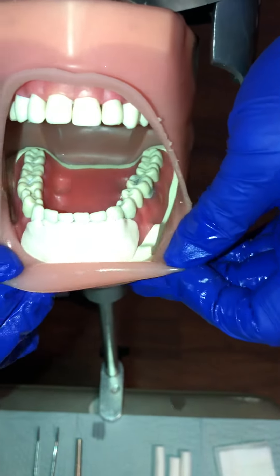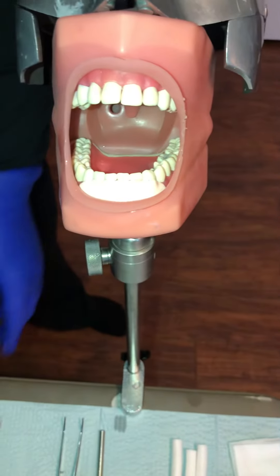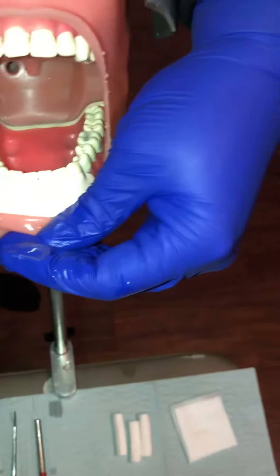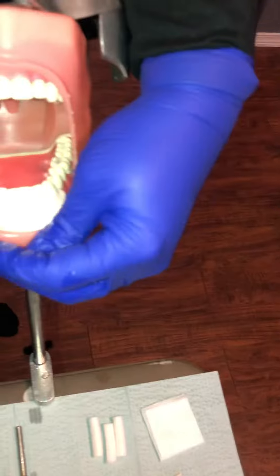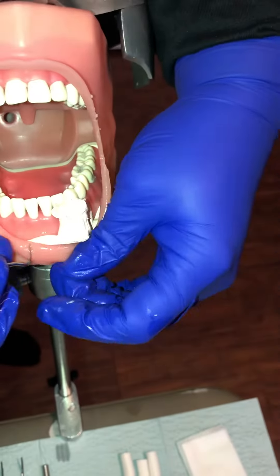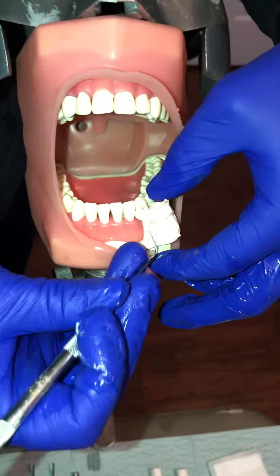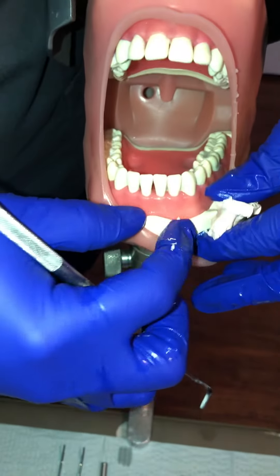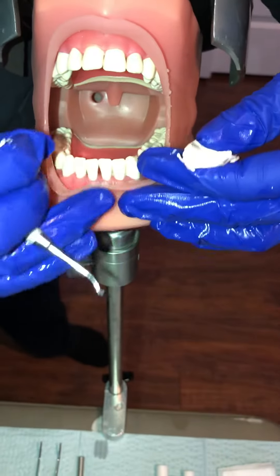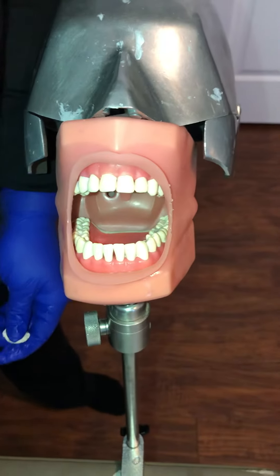So there is the periodontal dressing. When the patient comes back a couple of weeks later to have it removed, all you need to do is take a scaler, start at one side, lift up, and it just rolls and lifts off. Be careful, because the tissue is still healing and still fresh — you don't want to disrupt that. Get any little pieces, and then the doctor would take a peek and make sure everything looks good. That is how you place the periodontal dressing.